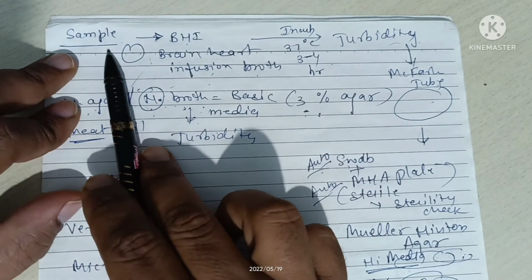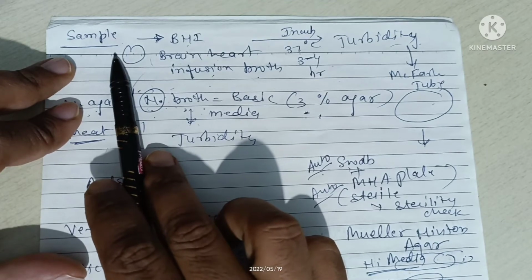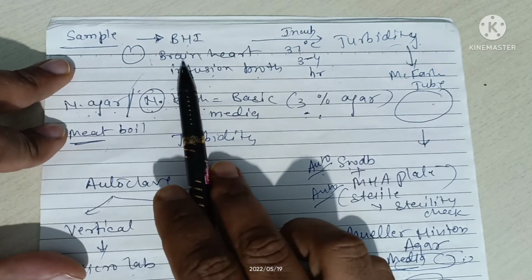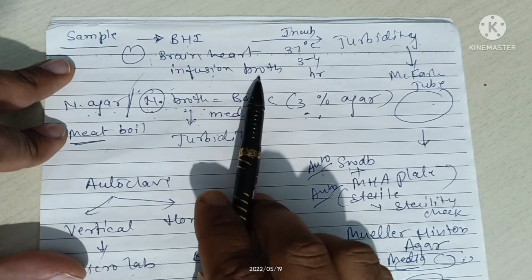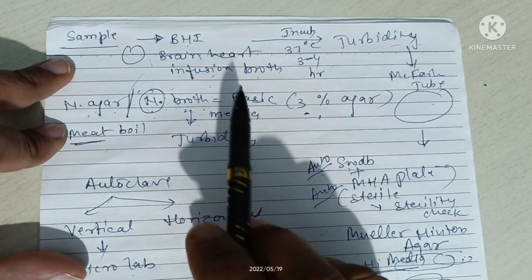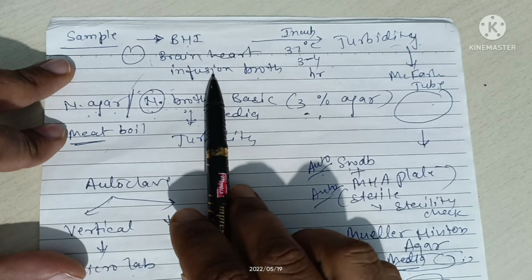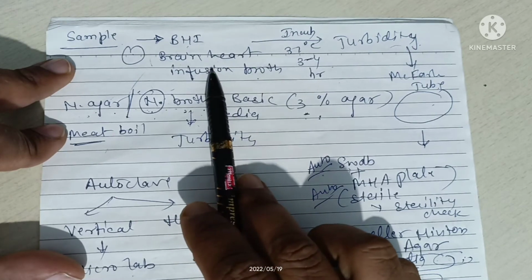In the microbiology department or the laboratory, we have to inoculate it into the BHI broth. The full form of BHI is brain heart infusion broth. Why do we call it brain heart infusion broth? Because this broth contains the extract of the brain and heart. And why is this infusion broth taken? Because it is rich in nutrients and almost richer than the normal nutrient broth. So the BHI is taken just for enrichment.